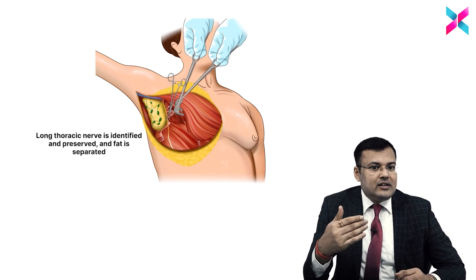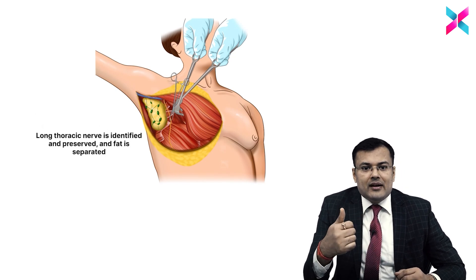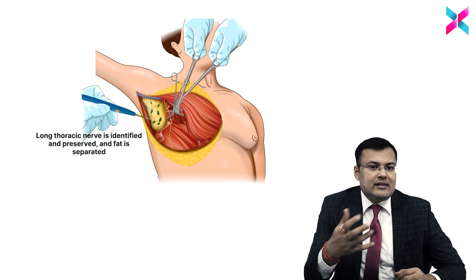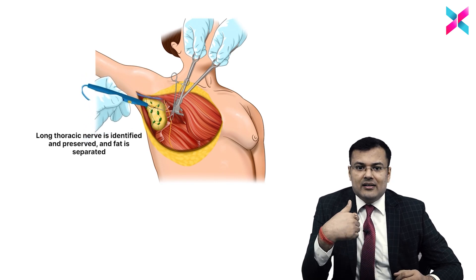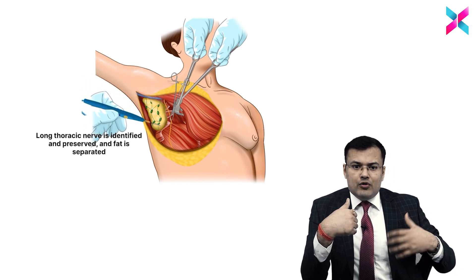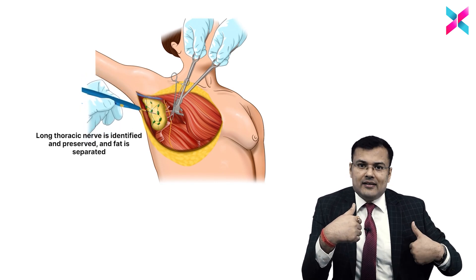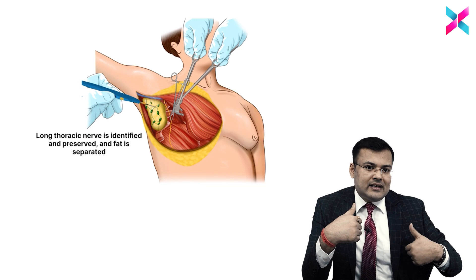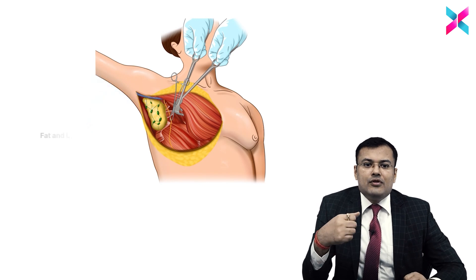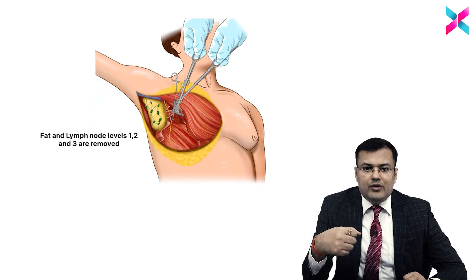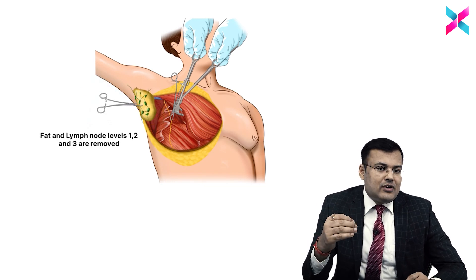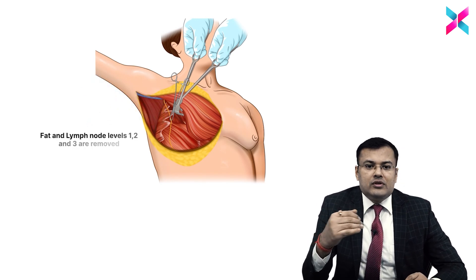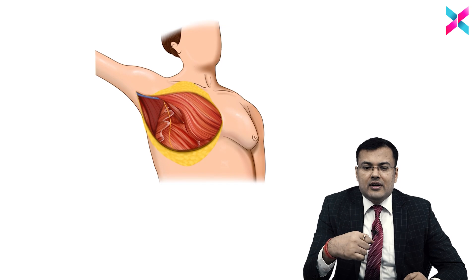After that, you can see there is a nerve supplying the serratus anterior — the long thoracic nerve. It is retracted and we are going to dissect the fat. The fat is dissected and the lymph node is removed. Fat and lymph nodes at level 1, 2, and 3 are removed.